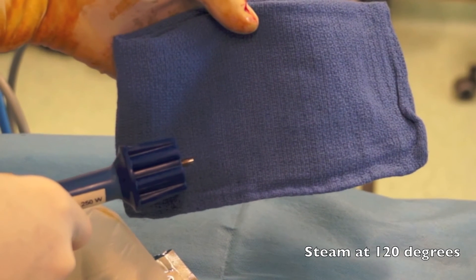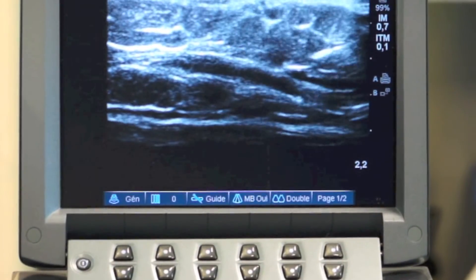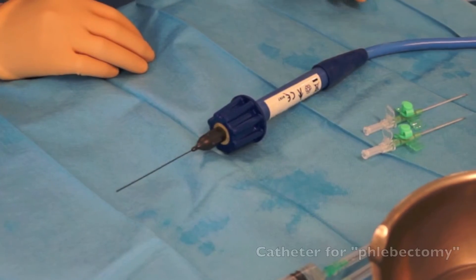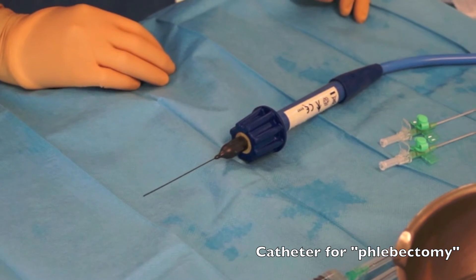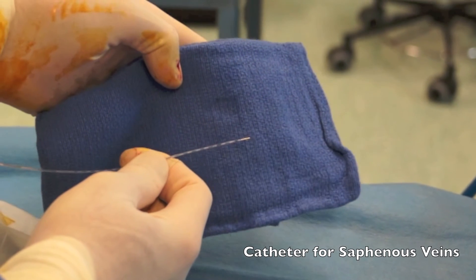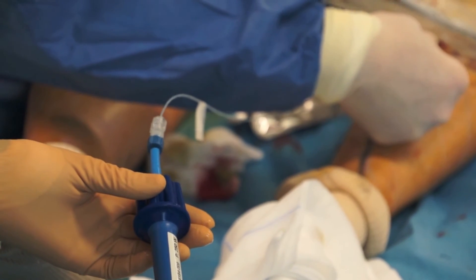The catheters are inserted into the veins under ultrasound guidance, followed by the injection of tumescent local anaesthetic around the veins, again under ultrasound guidance. A special catheter has been designed for phlebectomy — the steam comes straight out of the end. For the saphenous veins, the steam comes out of two tiny side holes. The catheter is then withdrawn down the length of the saphenous vein as pulses of superheated steam are delivered.